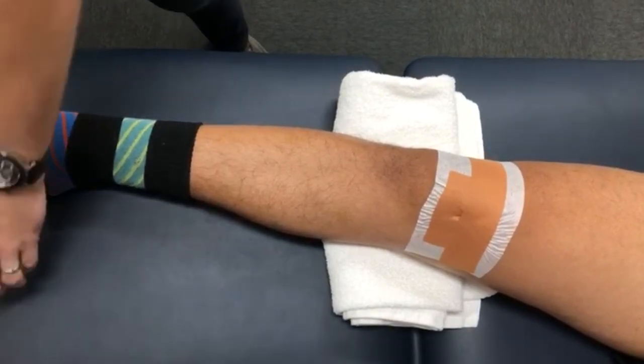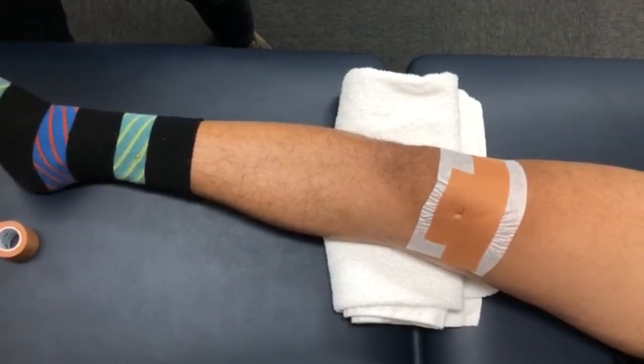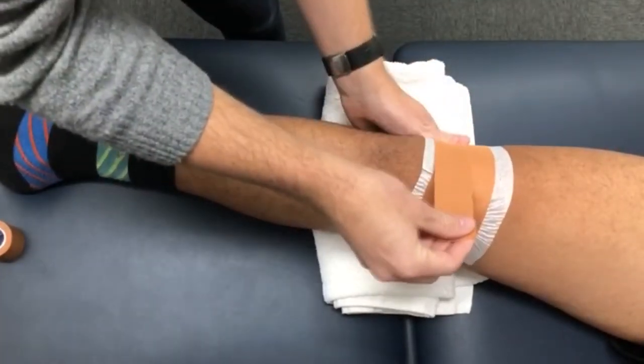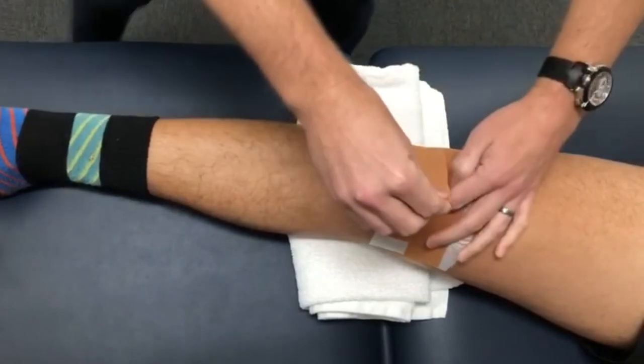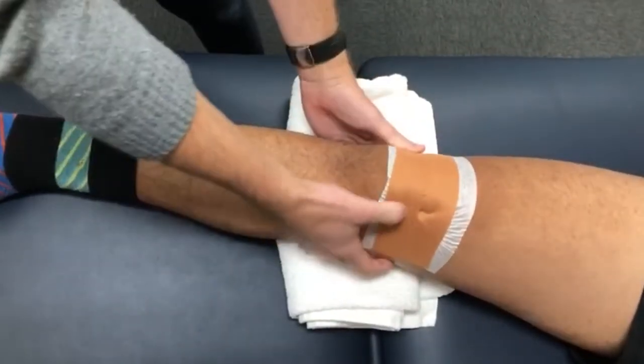As mentioned, this tape is meant to provide stability to the knee, giving you structure and support so that you can do the things you love, like walking the dog, completing your exercises, and getting things done around the house. The tape works by restricting some movements which may have been contributing to your pain — if the patella or kneecap was moving too freely, it may be the reason why you were feeling some discomfort underneath your knee.